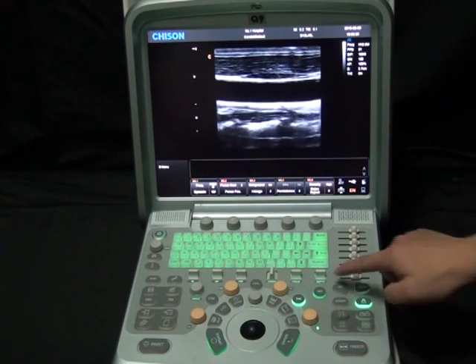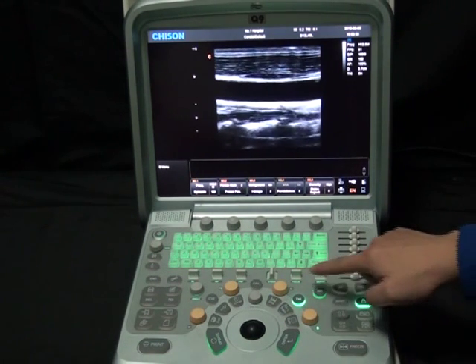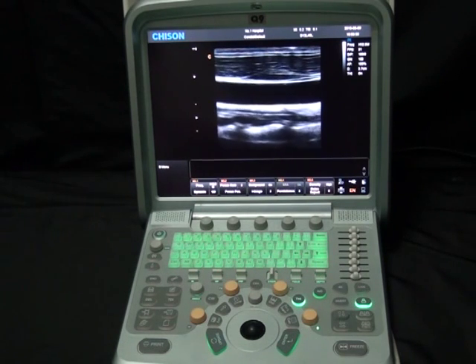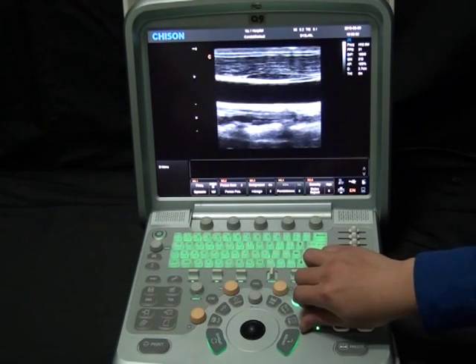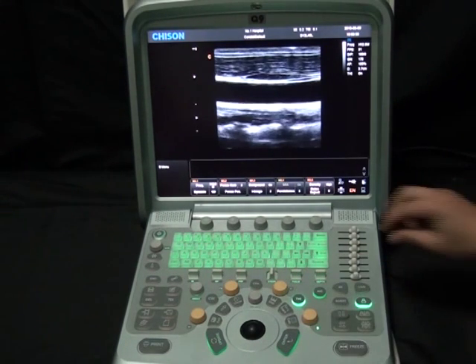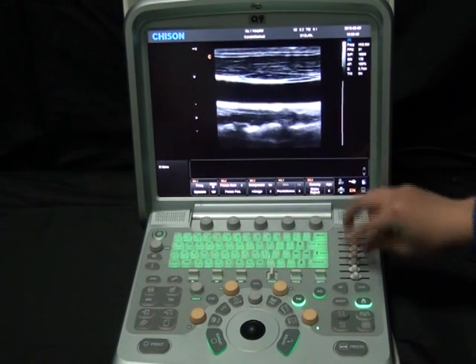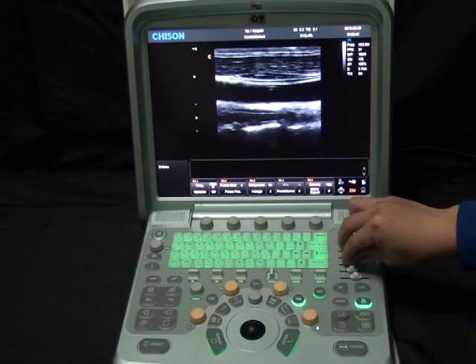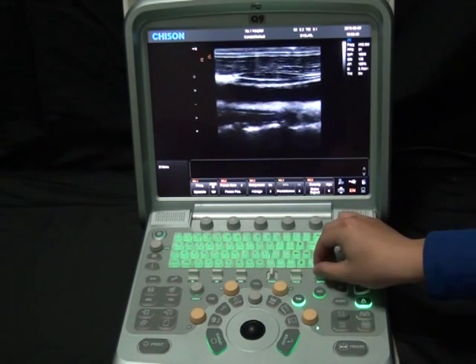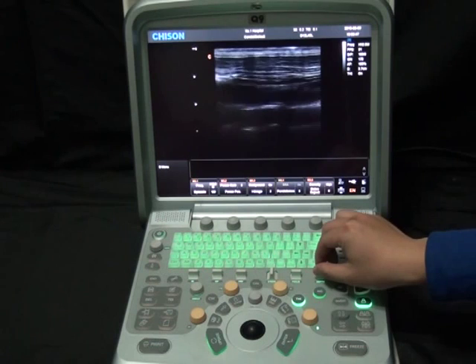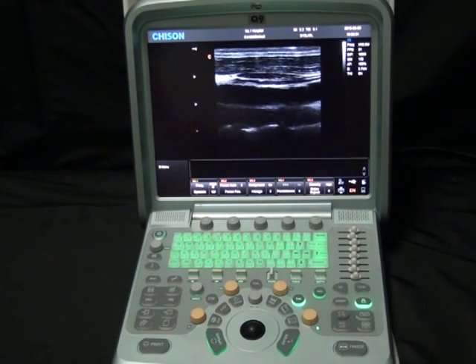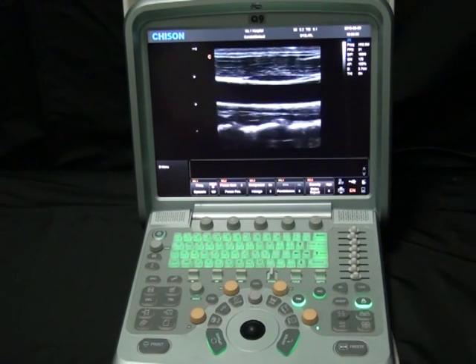In B mode, we will adjust the gain, depth, and focus position to make the image more suitable. Twist button B to adjust the overall gain, while sliding the different segments of TGC changes the gain at different depths. Tilt the depth pedal up and down to adjust the depth, and tilt the focus pedal up and down to adjust the focus position.